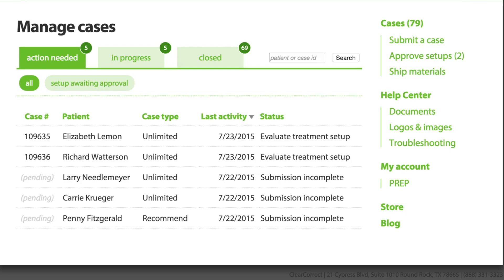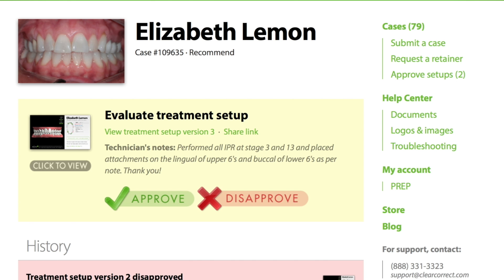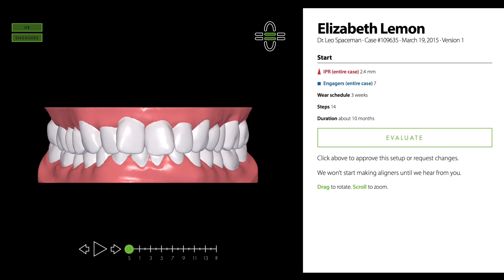Treatment setups appear in the case list on doctor.clearcorrect.com when they're ready for your review. Click a case in the list to visit its case page. You'll find the treatment setup near the top. Click the treatment setup icon to open the setup in your web browser.